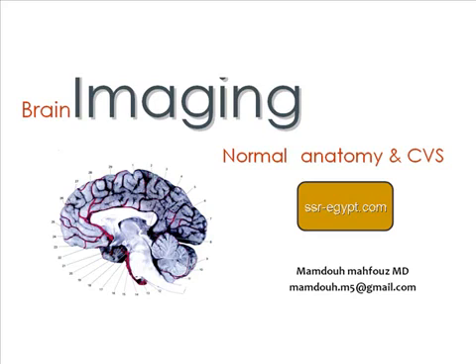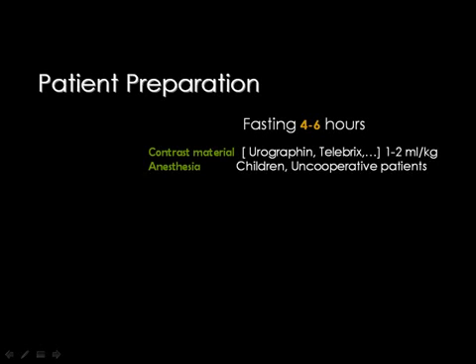But now we are talking about the brain, and we will emphasize some of the anatomic landmarks as well as the diagnosis of the cerebrovascular lesions. In order to have a CT scan of the brain, there should be some patient preparation. The only preparation required is to let the patient fast for about 4 to 6 hours: 4 hours for children and 6 hours for adults.